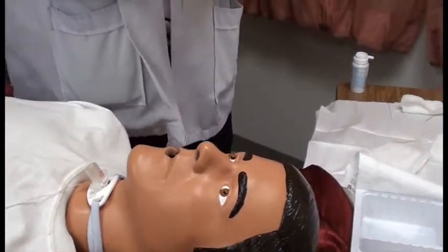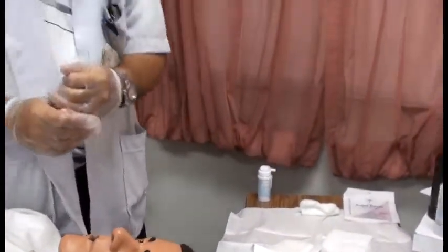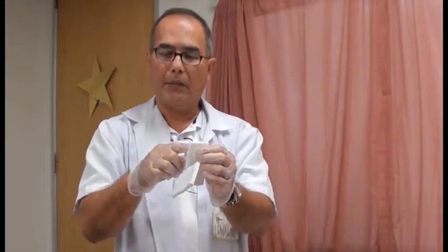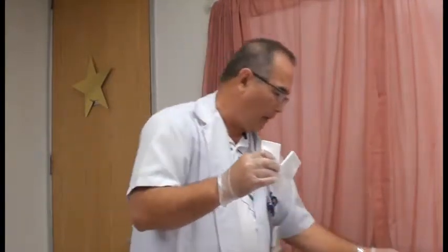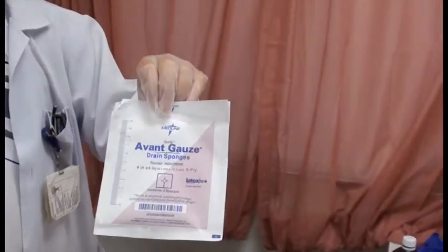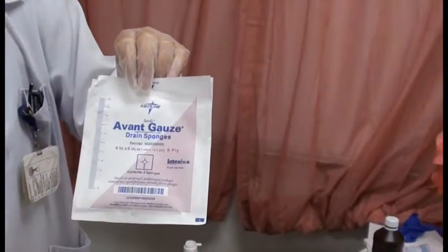Okay, at this point, we're going to go ahead and put the trach sponge on. And as you can see, these are already pre-cut. Some people will actually take a regular 4x4 and cut it, but I don't like that because there's some sediments that can actually go into the tracheostomy. So what we have in the agency are these pre-cut drain sponges that the patient should have in their home.